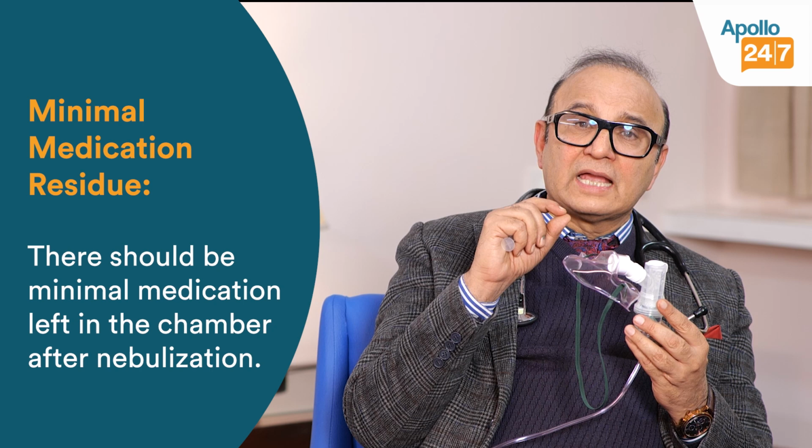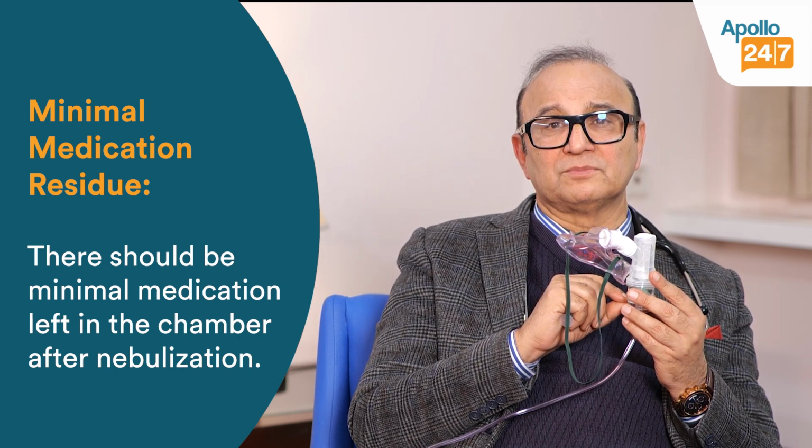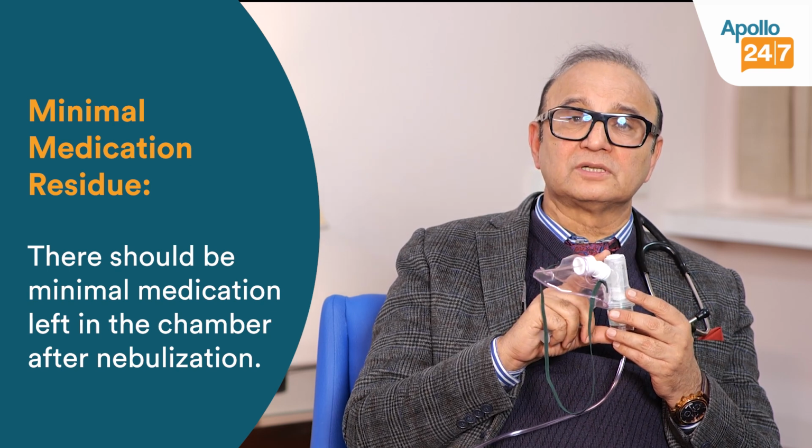And at the end of nebulization, very minimal amount of drug should be left in the chamber. If there is too much of a drug left, that means this nebulizer chamber is not proper. So all these things you should keep in your mind when you are buying a nebulizer machine for day-to-day use.